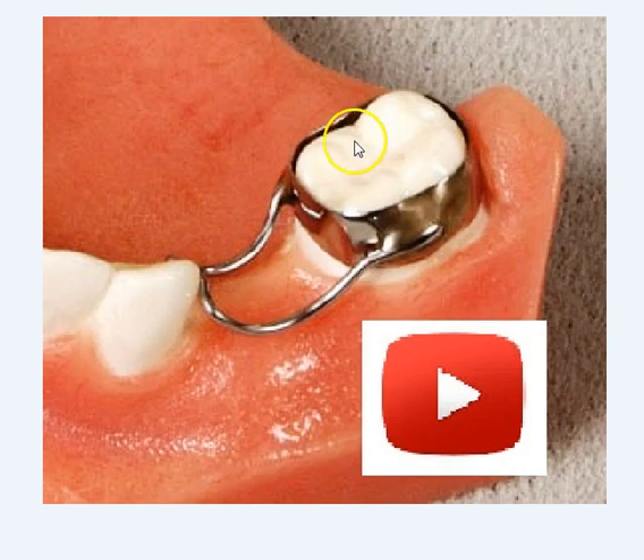If the molar has not fully erupted, and a second primary tooth is lost, the first primary tooth can be banded and looped to the mesial of the molar to prevent mesial drift and, in addition, allow it to continue to erupt.